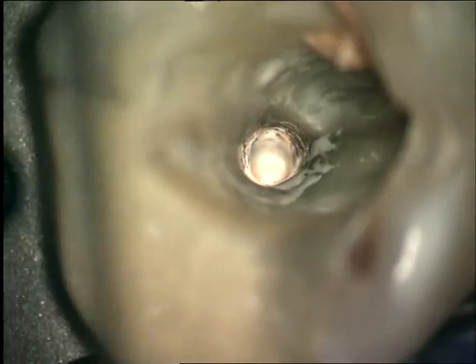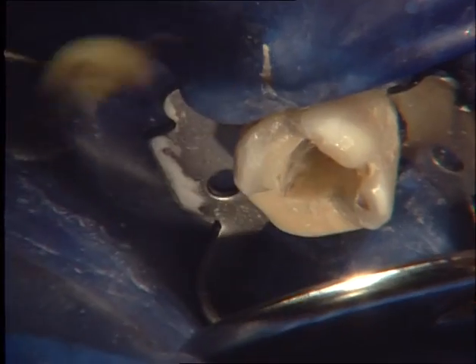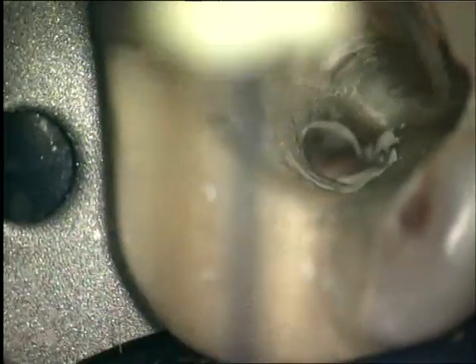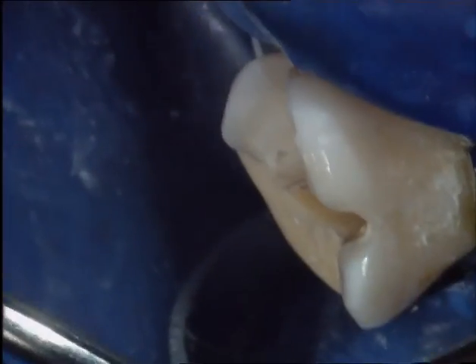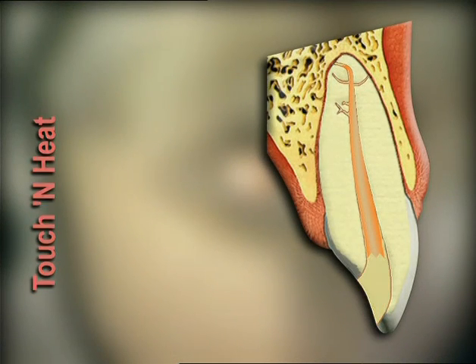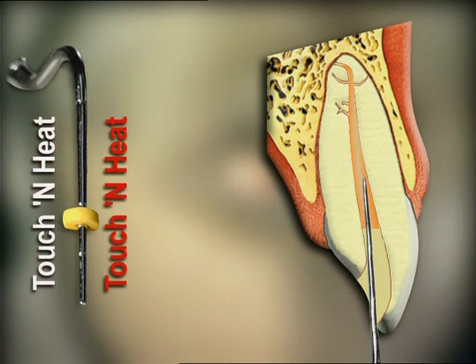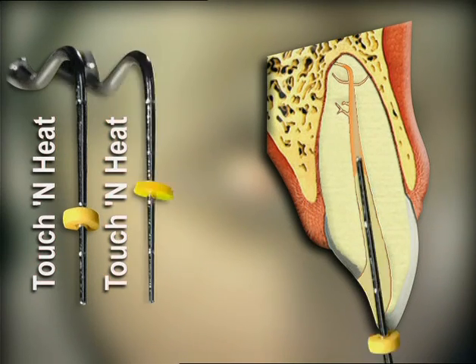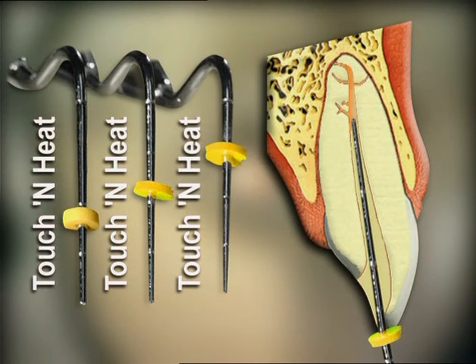Following the last heating and gutta-percha removal cycle, a sustained vertical press on the plugger for 10 seconds will produce the final wave of condensation. This will effectively offset any shrinkage that may occur during the gutta-percha cooling cycle. The downpacking is characterized by rhythmic heating with the probes and compaction with pluggers of decreasing size. In most instances, the apical portion of the preparation is sealed when compaction is occurring 5 to 7 millimeters from the apex.